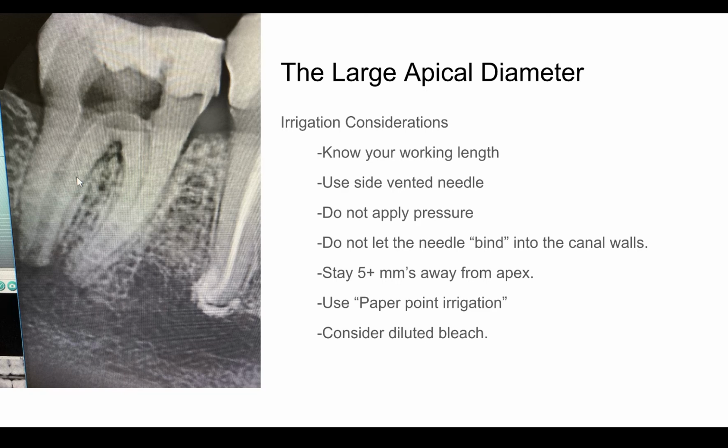With that said, this might be a time where you have to make a compromise to keep the patient safe. Use your best clinical judgment on whether or not you think diluted bleach is the right play. You might want to consider using other irrigants, such as chlorhexidine. I would be very comfortable using bleach here, just following these other considerations, but something to think about.